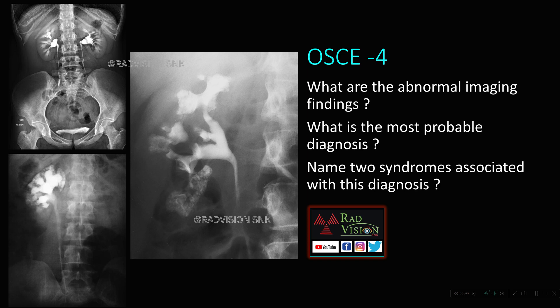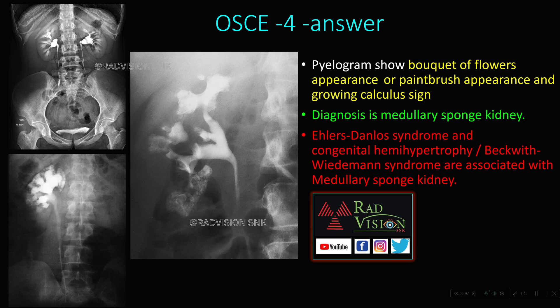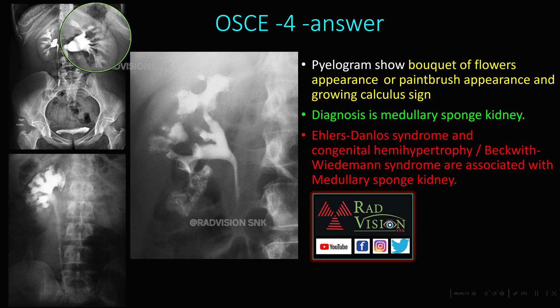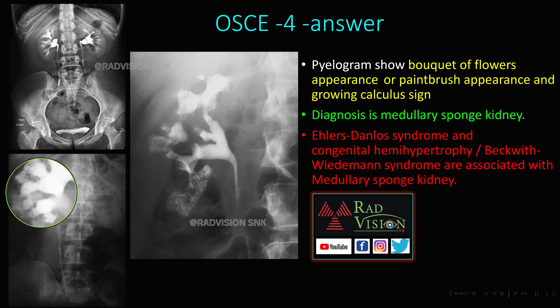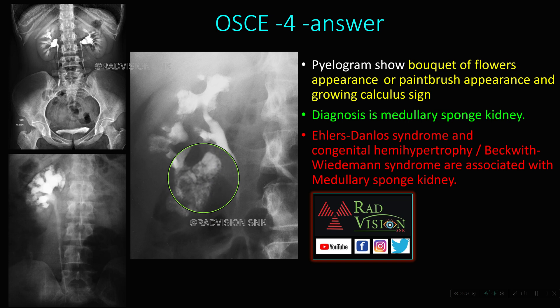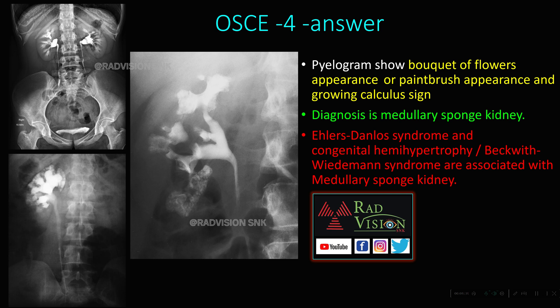Next, this is the fourth OSCE. What are the abnormal imaging findings, most probable diagnosis, and named syndromes? Here you can see multiple contrast-filled tubules noted — these show a streaky, paintbrush-type appearance. These multiple abnormal paintbrush appearances form a bouquet-of-flowers appearance. Also visible is the growing calculus sign, where there is a dilated calyx with calcifications — calyxeal diverticula with calcifications leading to the growing calculus sign. All these features — paintbrush type appearance, bouquet-of-flowers appearance, and growing calculus sign — are seen in medullary sponge kidney. Associated syndromes are Caroli syndrome and congenital hemihypertrophy or Beckwith-Wiedemann syndrome.